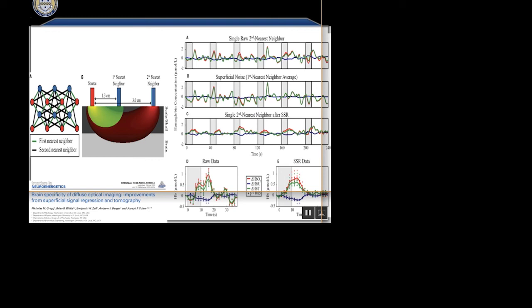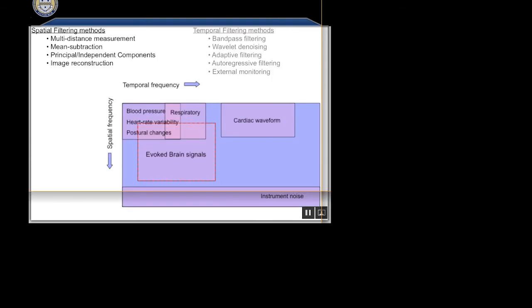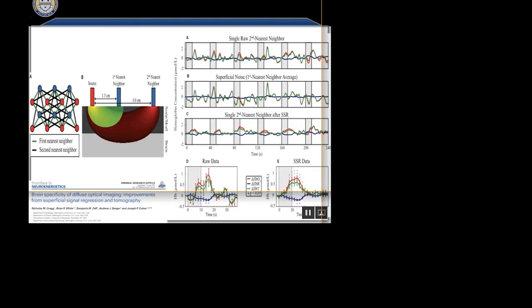There are some circles of fNIRS, like the ones I have to publish in, which are mostly reviewed by people that do only methods, where they almost insist that you do this kind of stuff. I think it's a great idea to do short distance measurements. I feel that the field has not yet defined what the best approach to it is, but we all recognize that it should be done. So, yeah.